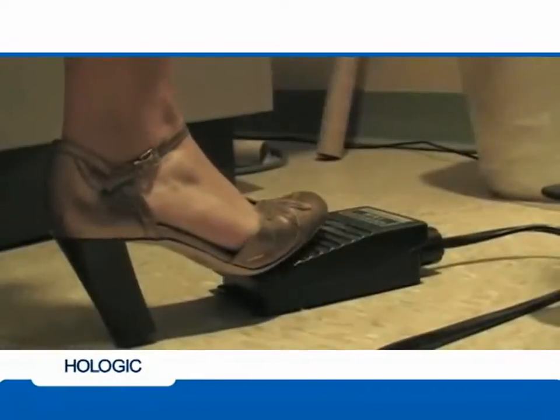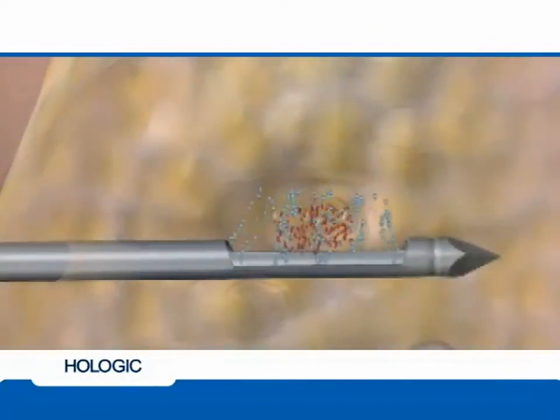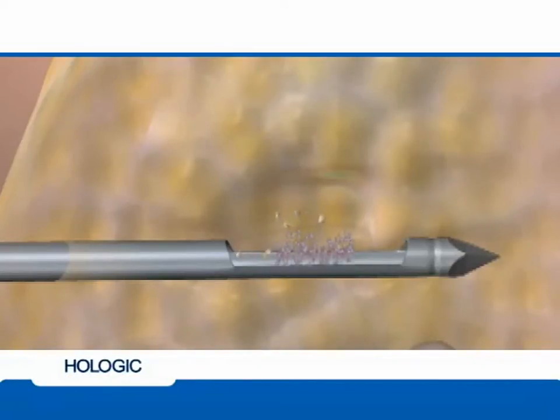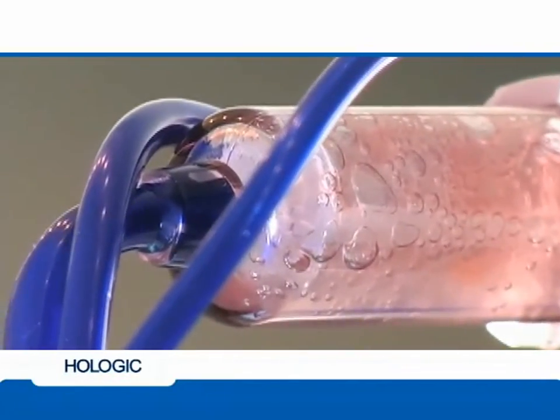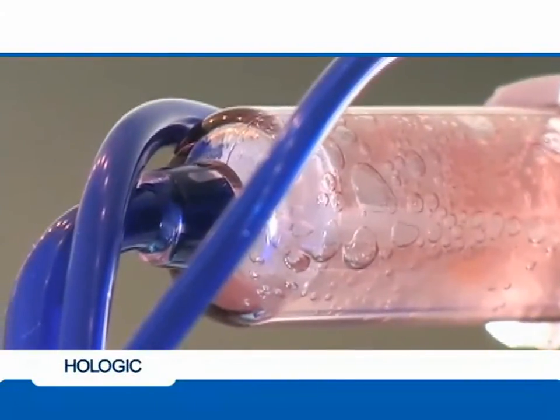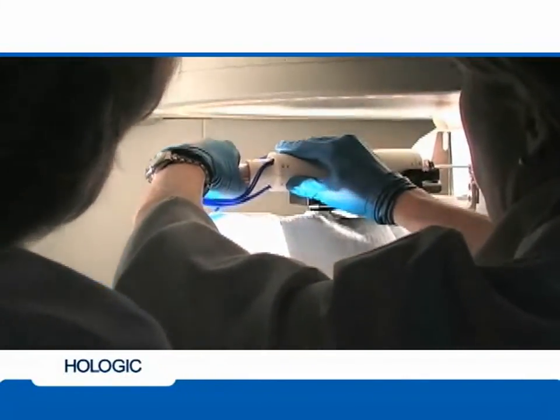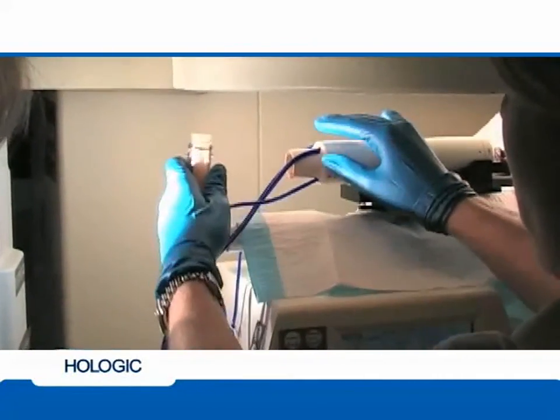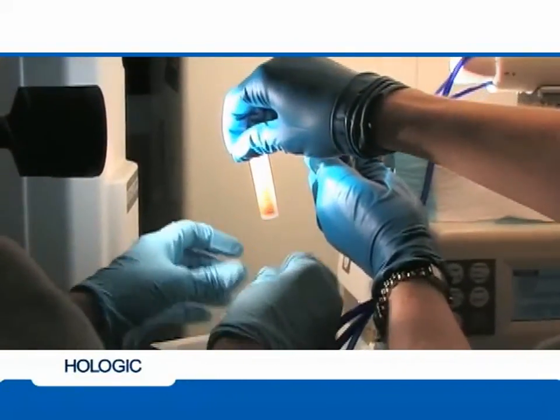When the necessary core samples have been retrieved, release the foot pedal and switch the console to lavage mode by pushing the button marked lavage. Lavage mode continuously delivers saline to the biopsy site and aspirates the biopsy cavity, allowing loose tissue and other fluids to be cleansed from the site. Lavage the cavity until the fluid in the collection chamber indicates the cavity is clear. To retrieve the sample cores, leave the console in lavage mode and disconnect the saline line at the proximal end of the Y-valve. The cores are now ready to be retrieved from the tissue collection chamber at the back of the handpiece. Place one hand on the handpiece and the other on the collection chamber, then rotate the collection chamber counter-clockwise to disengage the container from the handpiece.